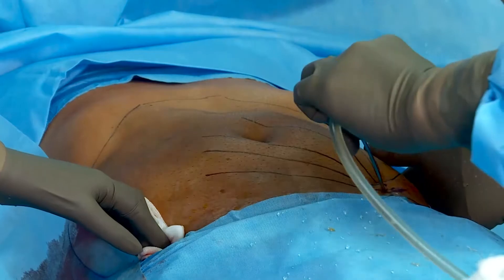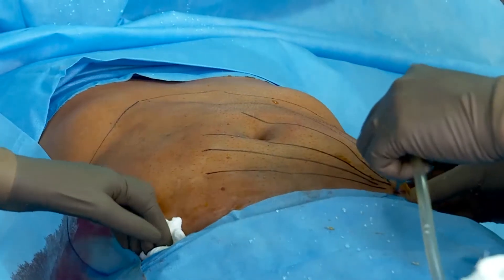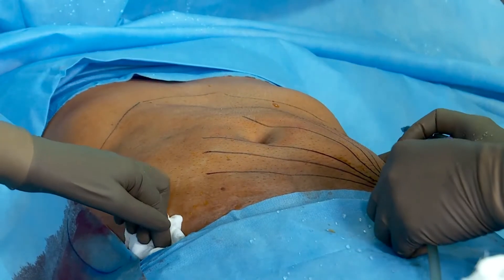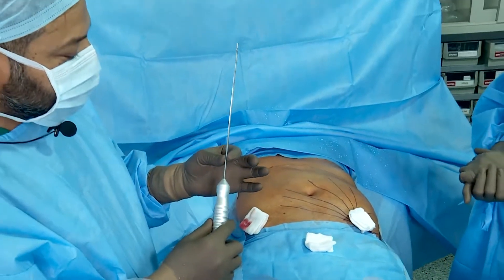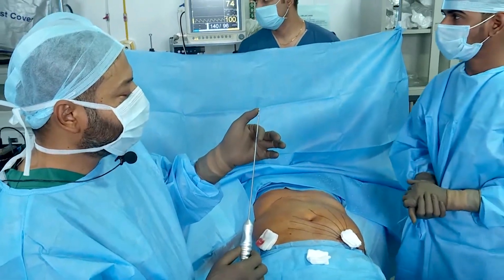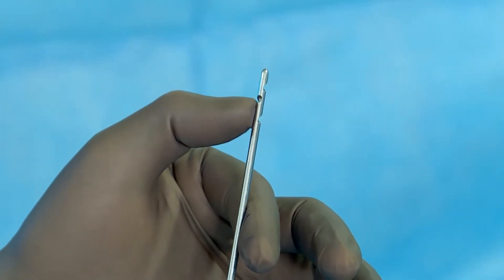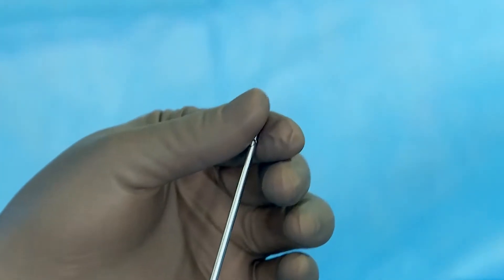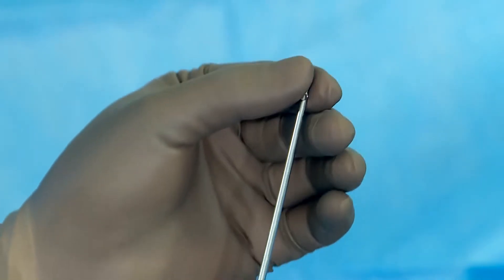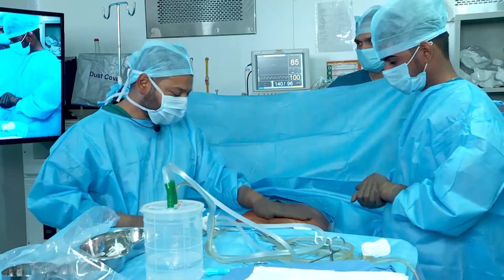From the same entry point, we go to the flank as well. This is the lipoaspiration cannula — less than 3 millimeters in diameter. It has 3 holes in the distal part. These holes have a special design: they are blunt on the tip, but the inner aspect of the crests is sharp, so it cuts the fat and brings it up, but on superficial palpation it does not hurt. It is quite safe even in a conscious patient.